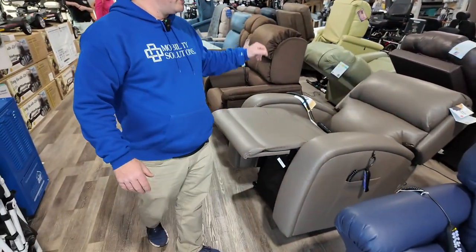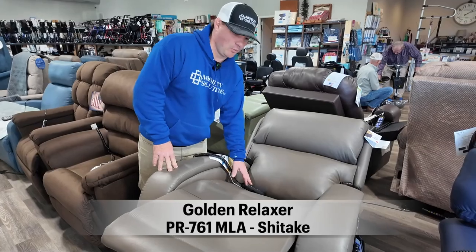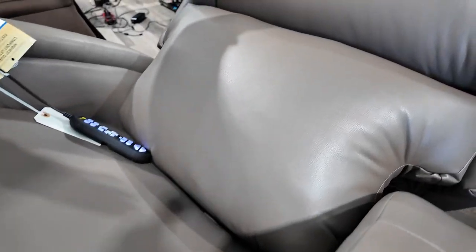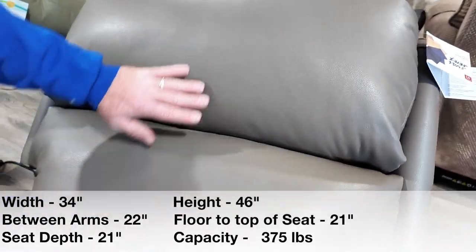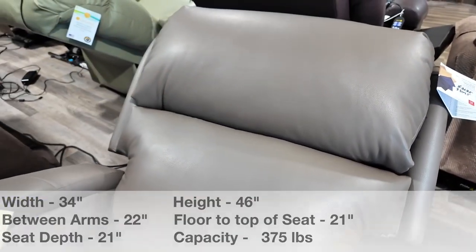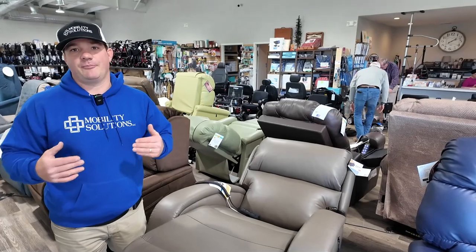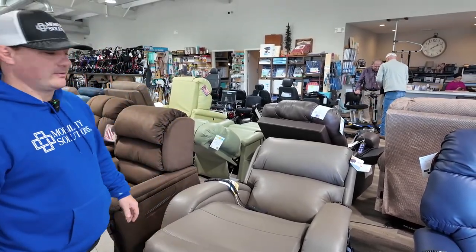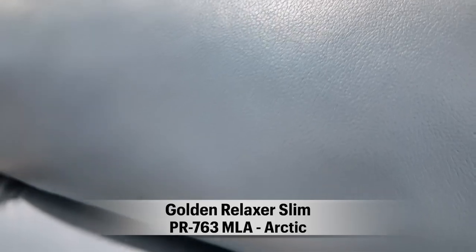Right beside it is another Twilight technology chair — the PR761 in Shiitake Brisa with Twilight technology. The difference between the two chairs is really just the look: it doesn't have the biscuit back like the other chair, it's more of a seam line back. You do have the lumbar, the power pillow, and the Twilight technology, but this one doesn't have the overstuffed arm. So if you're not using the lift mechanism to get up, it's a little easier to push yourself up. There's also a new Arctic Brisa available in the slim easy sleeper slim chair.